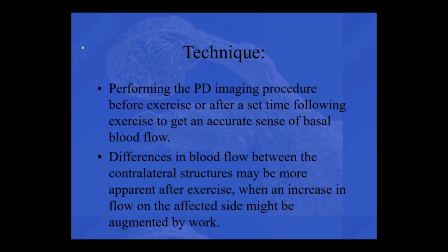Sometimes it could help to have a horse exercise and see more significant changes between the left and right leg or contralateral limb after some work. For sure you have to be a little bit more proficient already in power Doppler to do those things, but it could be really interesting to look at the same limb again before and after exercise with power Doppler. You might see more difference that you can appreciate after exercise than before.